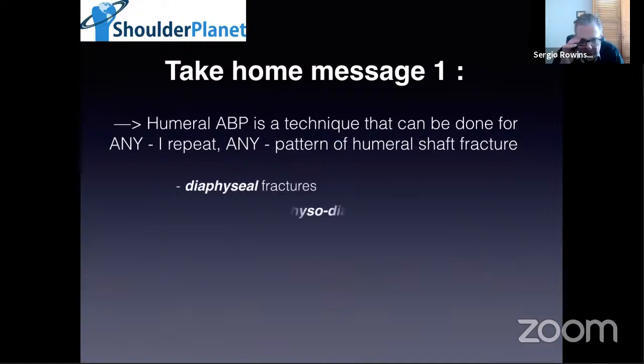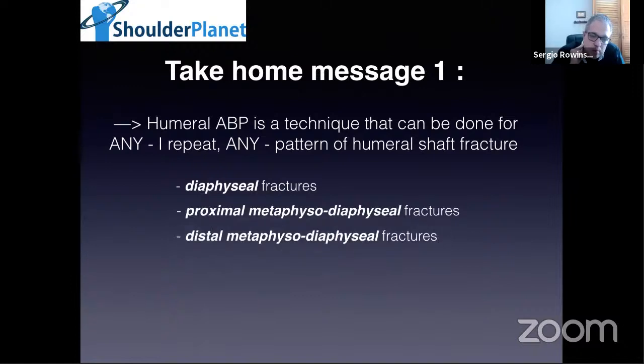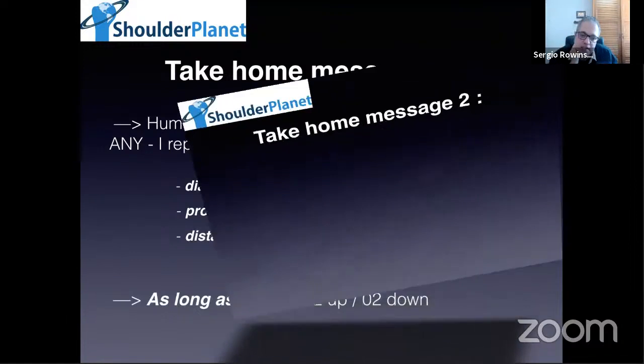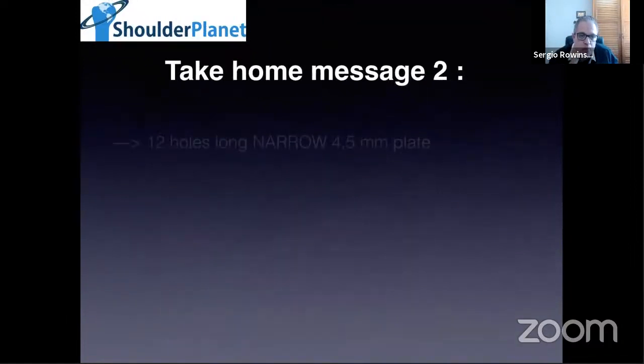In any pattern, this is what I like to call diaphyseal fractures: proximal metaphyseal-diaphyseal and distal metaphyseal-diaphyseal, as long as I can put 2 screws up, 2 down. This is my second take-home message.